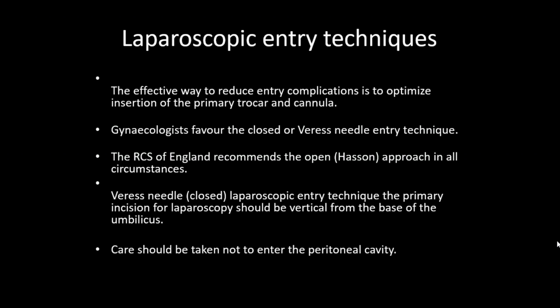Obesity will sometimes make it difficult to introduce the needle properly in a normal pathway and to get inside the intraperitoneal cavity. And with thin patients, the liability for vascular injury to a major blood vessel like the abdominal aorta or common iliac artery is very common.